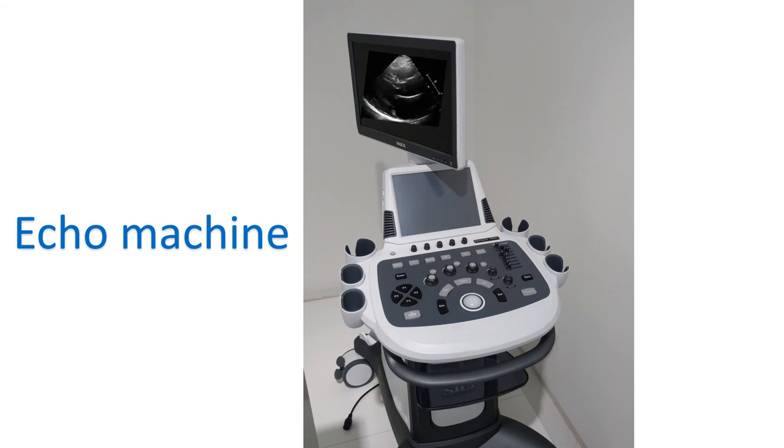Modern echo machines can also be connected to the hospital information network using LAN, local area network cables, so that physicians can view the echo images and videos on computers in their office as well. A picture archiving and communication system, PACS, can also be used in the hospital for storing and retrieval of echo information.